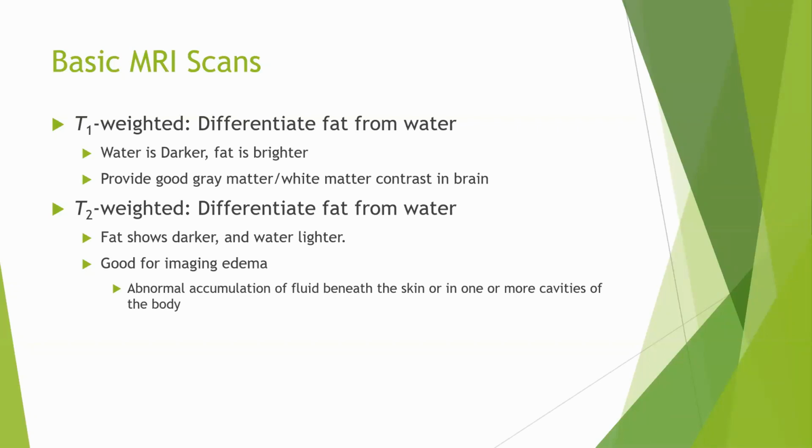So for me, as an osteopath and a chiropractor, it's not that I don't see T1, but for me, T2 weighted images are key. So when I read an MRI, I jump into T2 weighted. So please note it down wherever you are writing. T2 weighted images is what you are going to look at if you want to evaluate an orthopedic or musculoskeletal MRI.